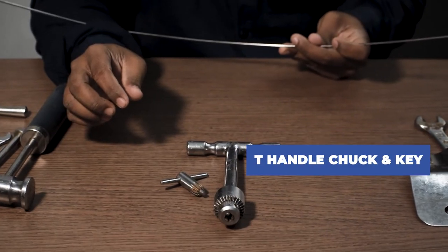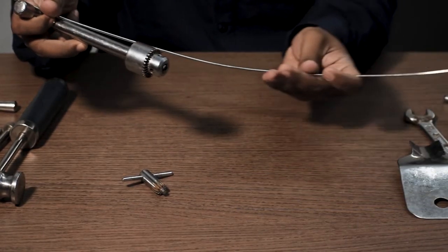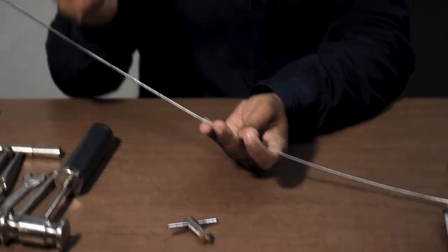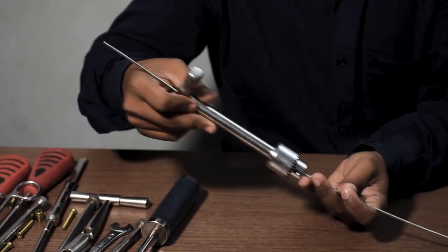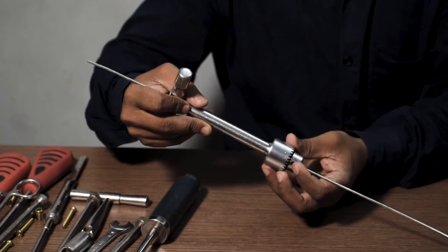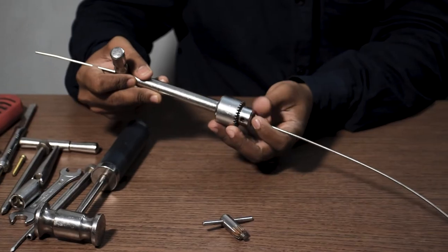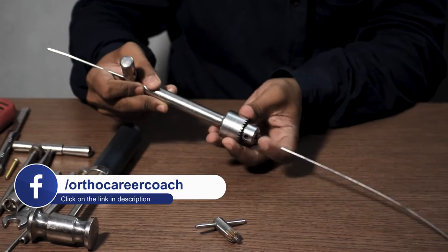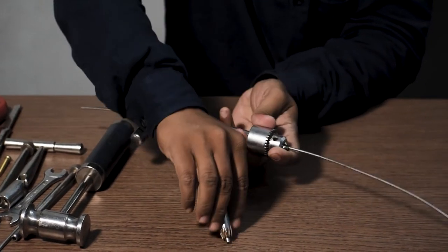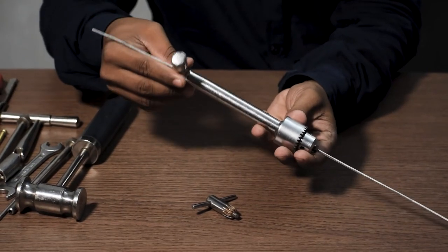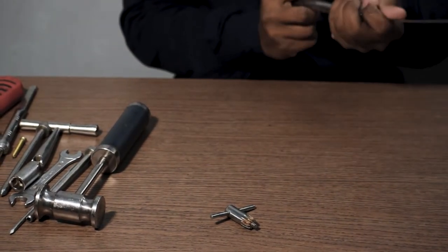This device is called a T-handle chuck with key. Now during the entry of the guide wire in the medullary canal, due to presence of blood in the gloves of the surgeon or the OT assistant, there is a chance of losing grip of the guide wire. That is when this T-handle chuck with key comes into play by holding the guide wire like this, and tightening it with the key like this, and thus we can pull, push, or rotate the guide wire with ease.